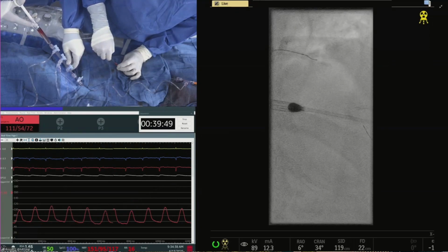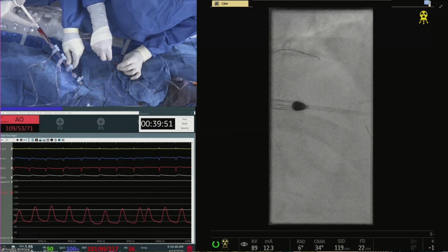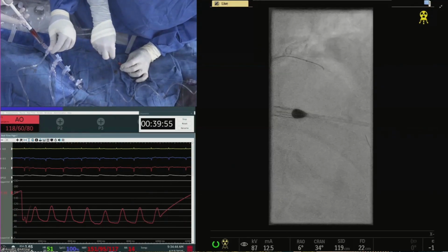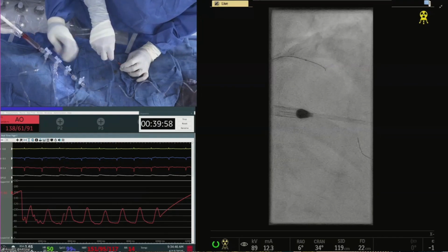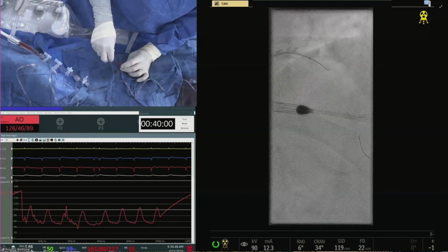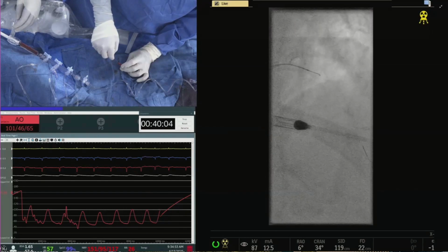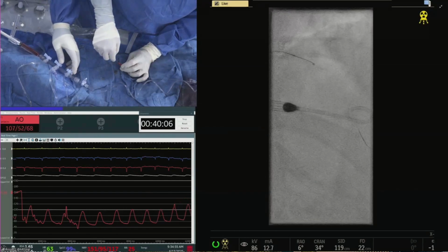Yeah, I also like your idea of dilating that diagonal, and maybe we may have to do that. Yeah, just do supercross. If you need supercross, you need to dilate it because you need a little space for that supercross curve to stay in the LAD.